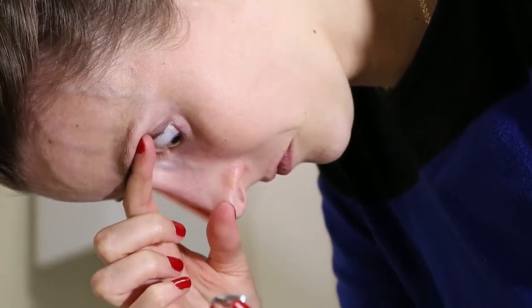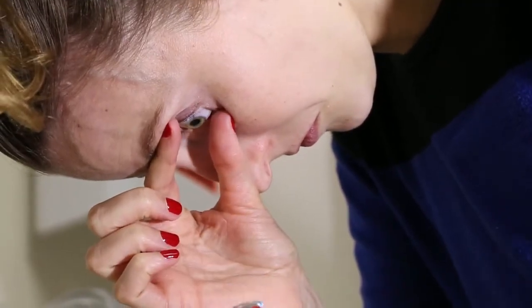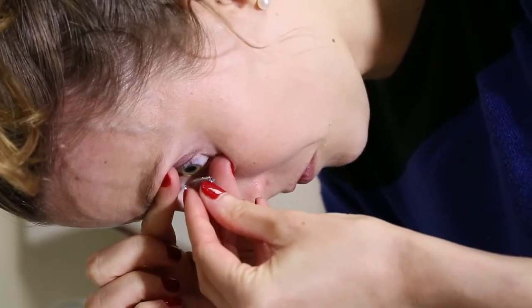Put your head 90 degrees parallel to the floor. Look down, grabbing the top lid at the lash margin. Look up, grabbing the bottom lid at the lash margin. Look straight down at the target.